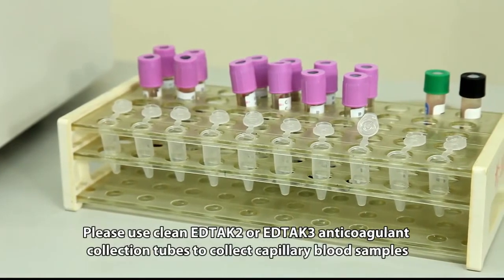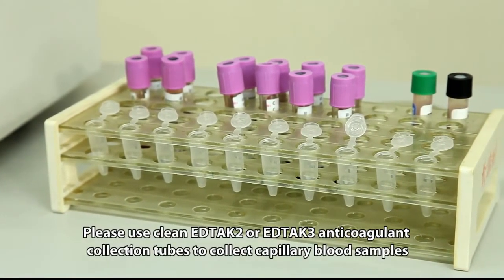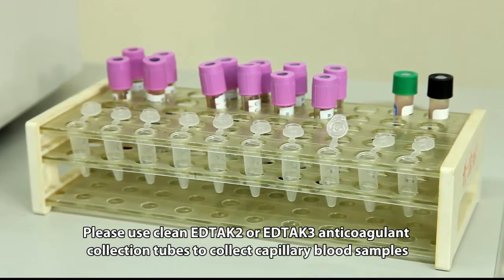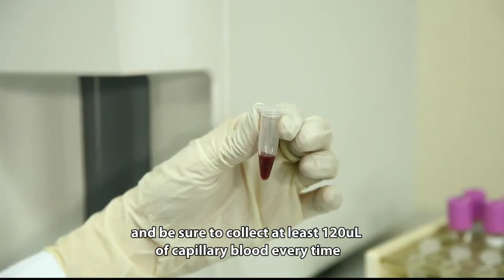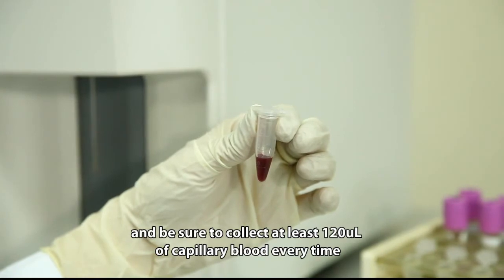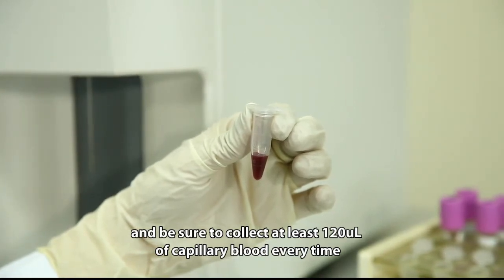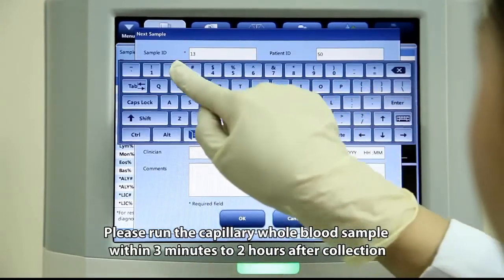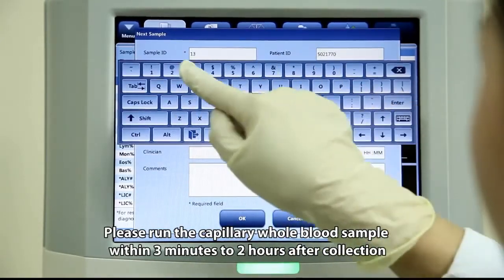Please use clean EDTA K2 or EDTA K3 anticoagulant collection tubes to collect capillary blood samples, and be sure to collect at least 120 microliters of capillary blood each time. Please run the capillary whole blood sample within three minutes to two hours after collection.